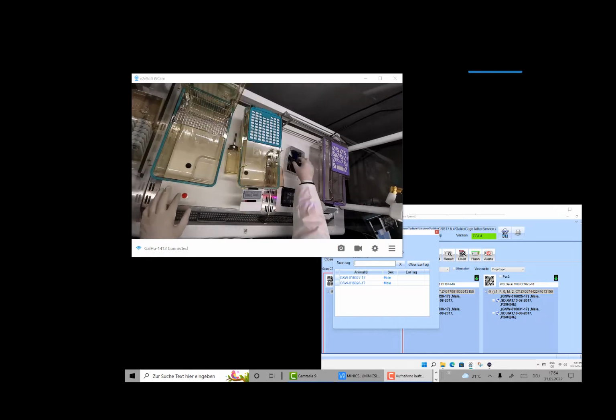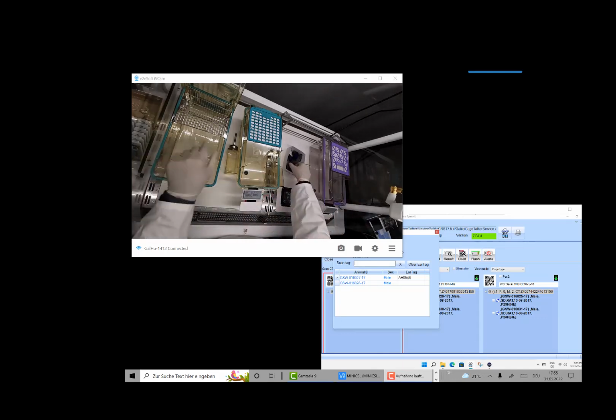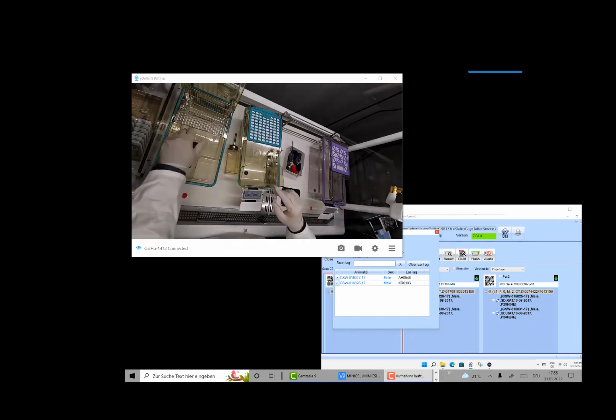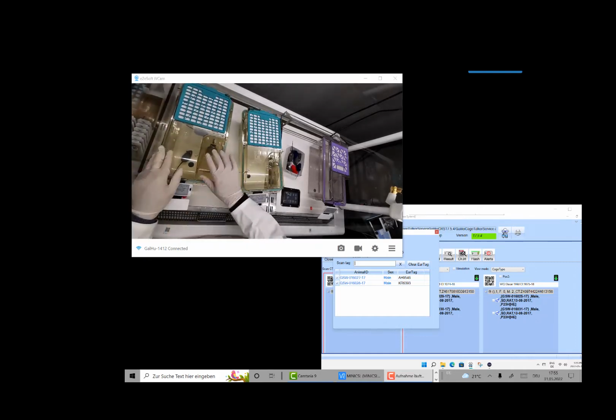I will just pick out of my box the animals which have been prepared with tags, but they also could have a transponder which you scan into that field and then put the animals. The procedure is pretty much the same, and I just do that with the scanner here. And when I've done that, I can close that cage and just go to the next one.